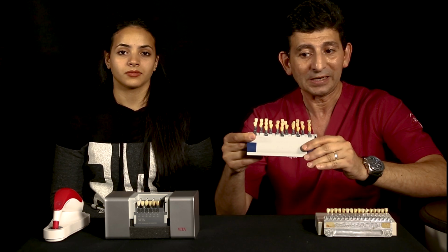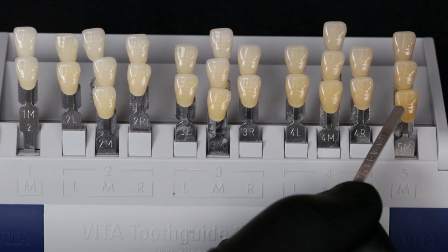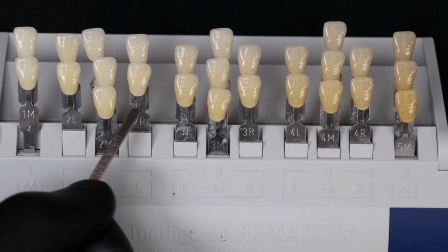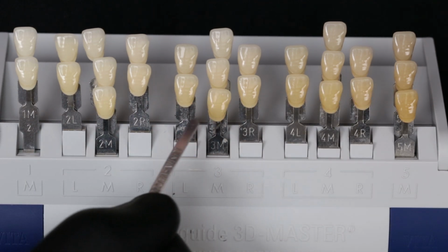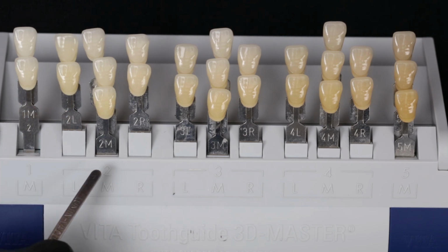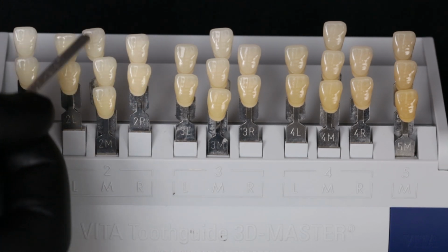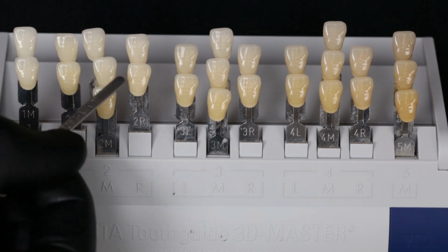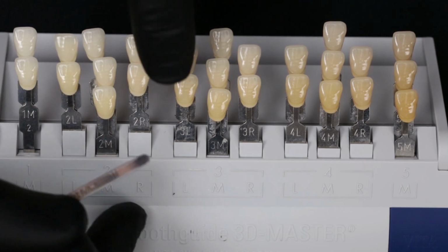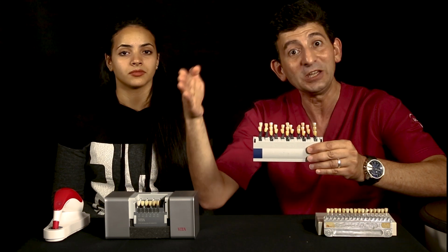The 3D Master is a value-based shade guide. That means you go horizontally from dark to light to select which value is close to the tooth itself. After you go horizontally, you select the group that's very close to the tooth, let's say group number 2. Then after you select this group, you go vertically, up and down, to select the chroma. And after you select the chroma, oh, this is the one, you go again horizontally to select the hue. So it's exactly the opposite of the classical. You select first value, then chroma, then hue.